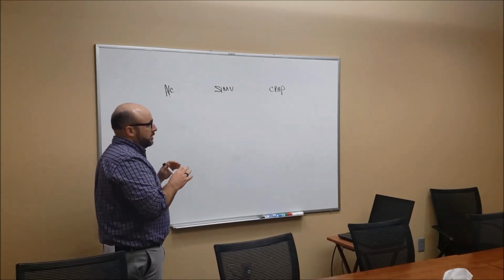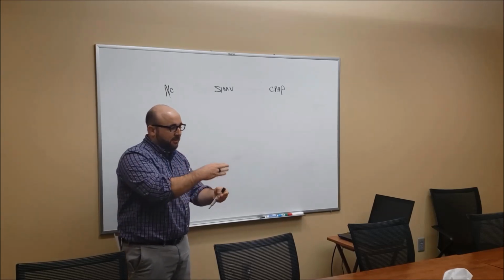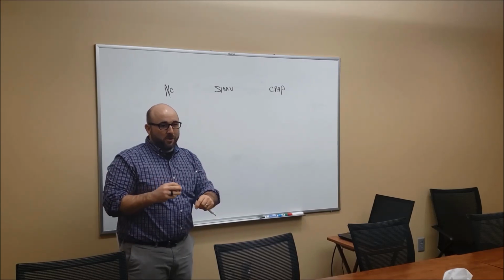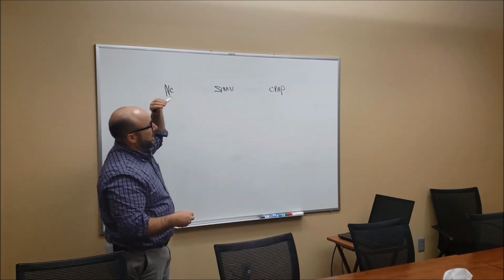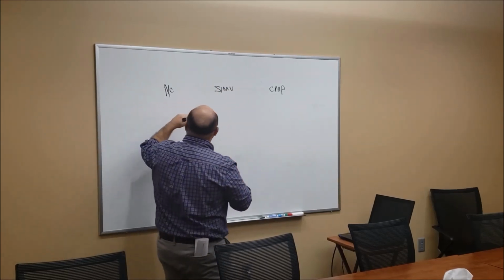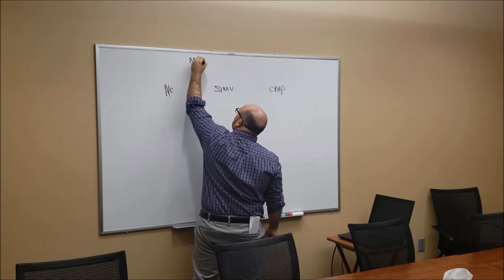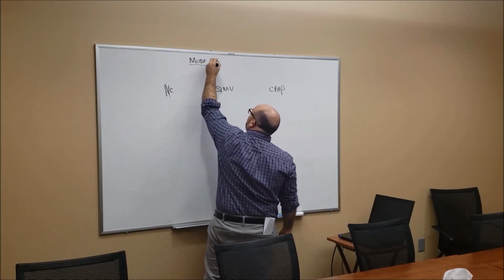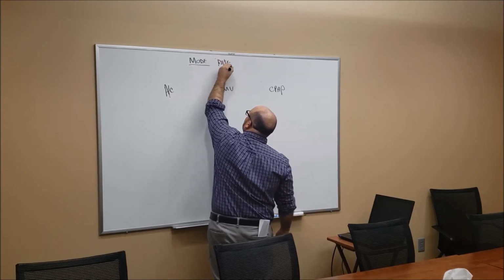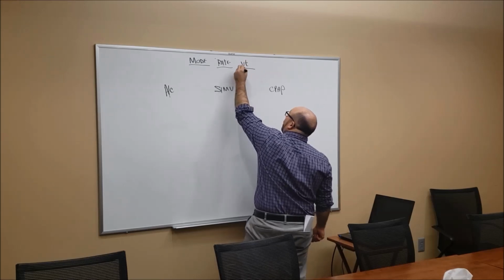They're always looking for, just like with a blood gas where you say the blood gas is 7.25, 55, 95, and 24. That's always pH, CO2, PO2, and bicarb. In this case, whenever you give somebody vent settings, you're always going to say the mode, rate, VT, which is tidal volume.